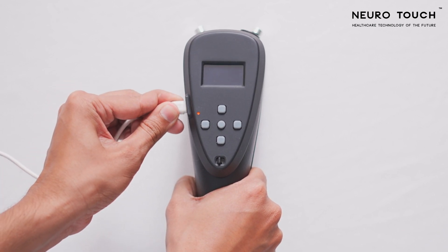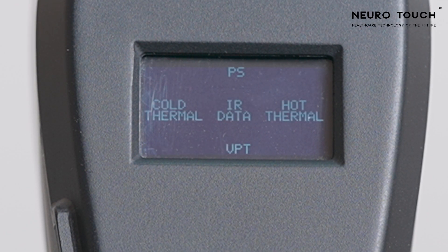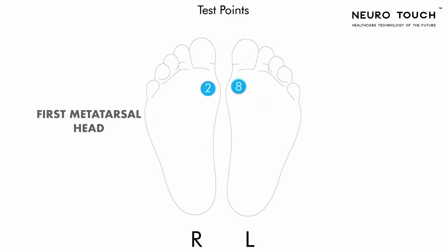Ensure that the device is fully charged. With three hours of charging, you can use NeuroTouch for about five hours. Toggle the power key to the right to switch on the device. After the splash screen, you can see the home screen where all the tests are aligned on the keypad. You need to perform the test on 12 test points on the patient's foot, starting from the right foot: Hallux, first metatarsal head, third metatarsal head, fifth metatarsal head, medial aspect of the foot arch, and posterior aspect of the heel.